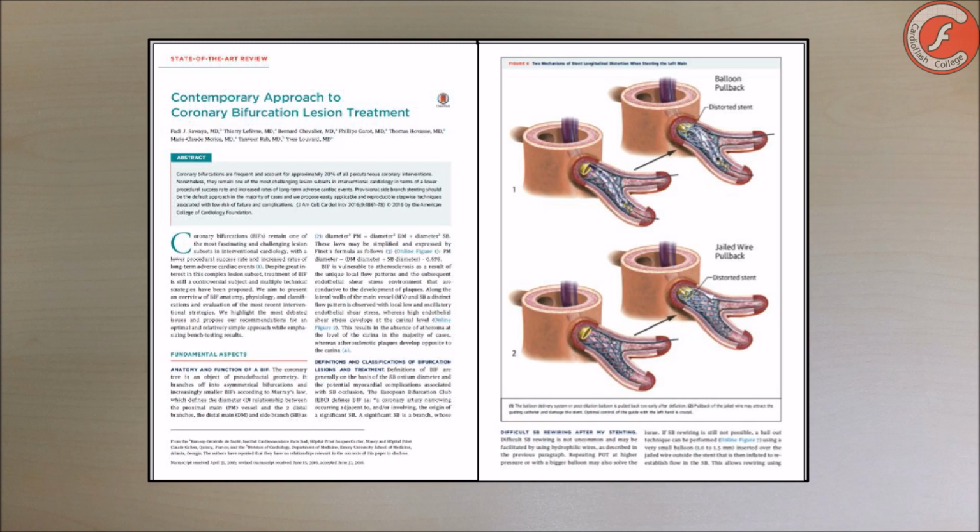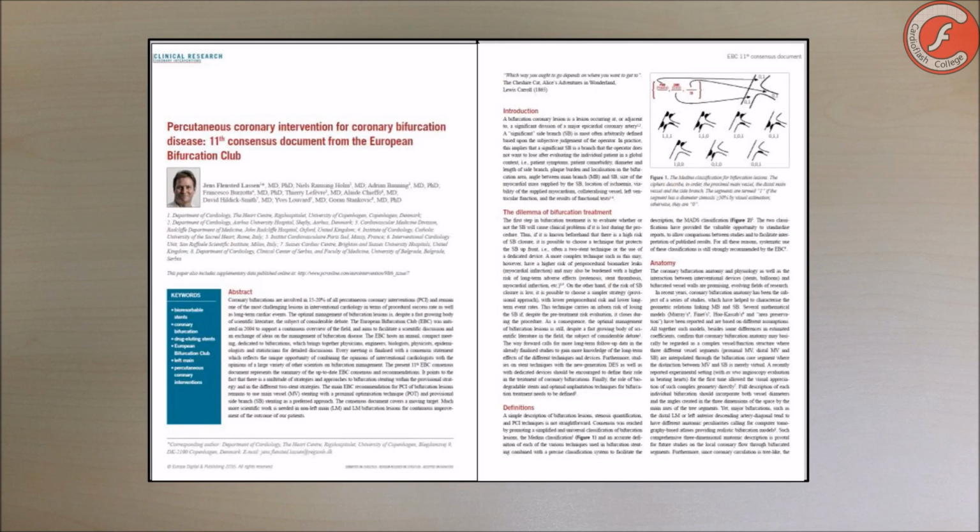As you know, coronary artery bifurcation lesions are frequent findings during coronary interventionism and represent, more or less, 20% of total angioplasties at any center, becoming an entire challenge from the technical and prognostic points of view. Because of these motives, different work teams and societies have dedicated lots of efforts and resources to the study of this entity, obtaining very diverse results.